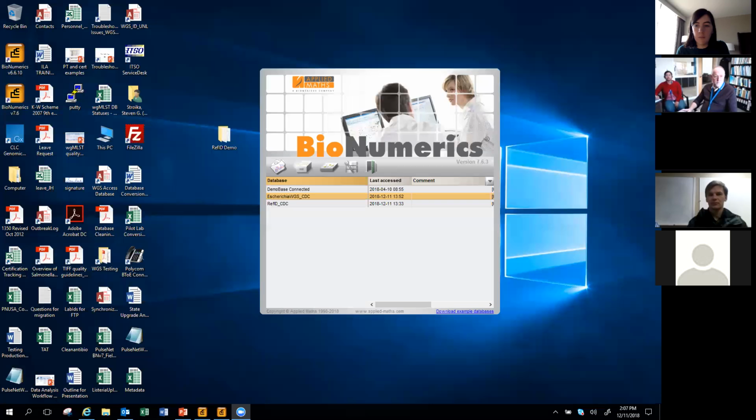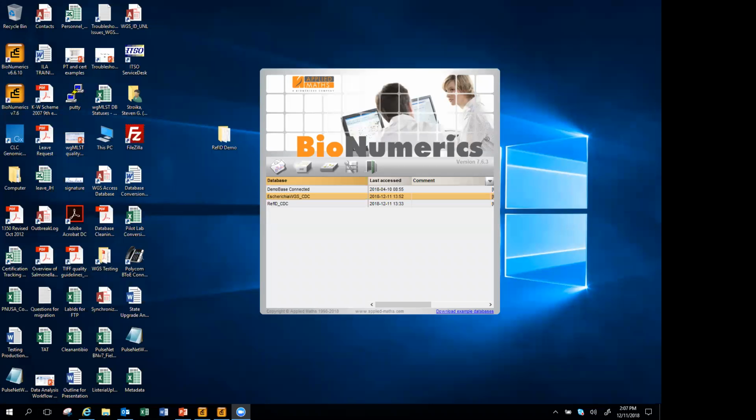Okay, thank you. I am trying now to share my screen. Does everybody see a desktop with BioNumerics? I do, yep. Okay, good.